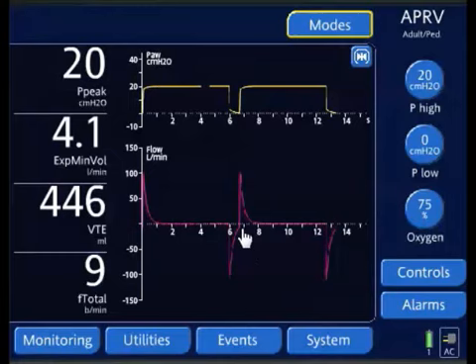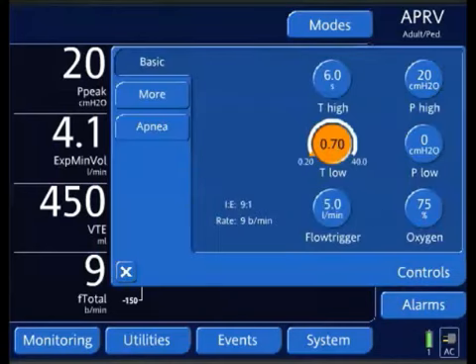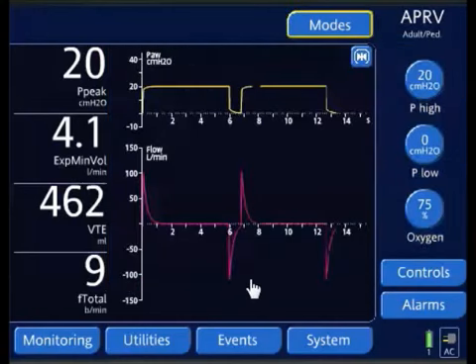As we notice, we lengthen the T-low a little more, and we're pretty much almost at baseline. So let's just extend it out to the calculated value of 4 expiratory time constants and see what the waveform looks like.